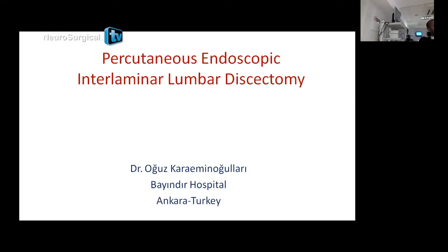Anybody has a question? Please ask any question. I wanted to ask about when you go posterolateral sometimes. Yes, for extraforaminal only. So you go directly on the fragment, posterolateral? No, I use the lumbar stick. So I go just into the nucleus and come back and turn to the foramen. It's safer.